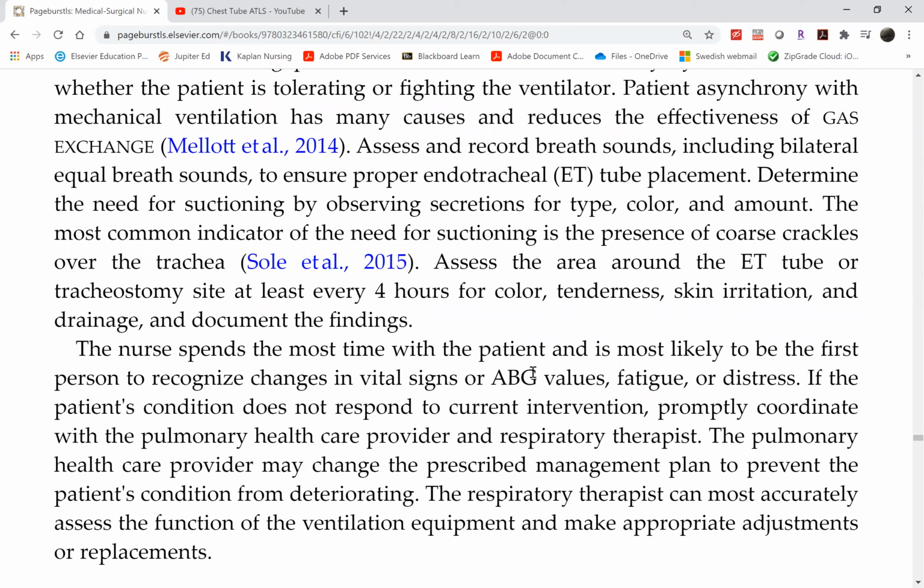Because the patient is sedated, you won't see mental status. If anything, you'll just see restlessness maybe. So your basic assessment data will come from your ABG. Whatever you do on the settings or modes on the vent will be reflected on the ABG 30 minutes later.